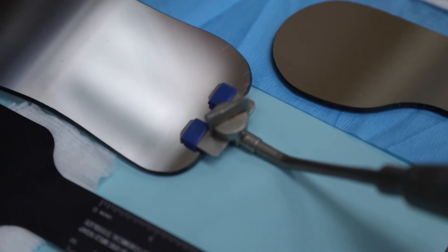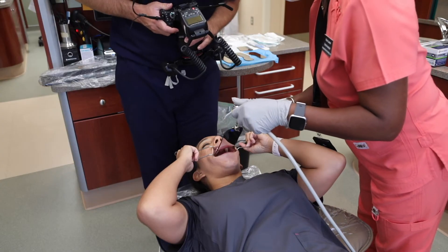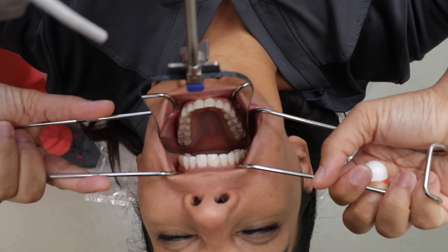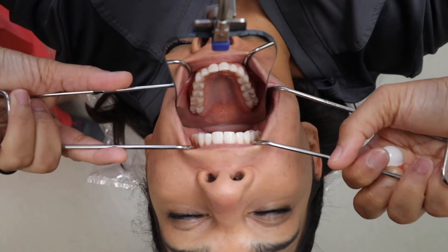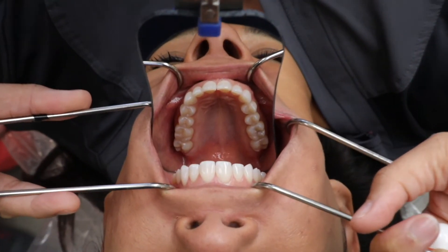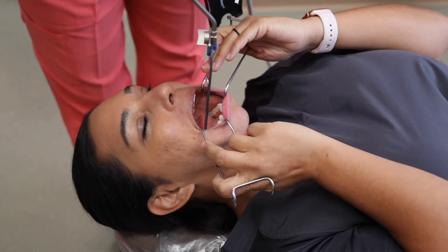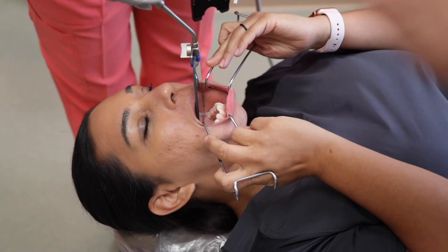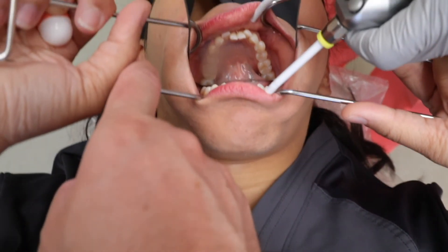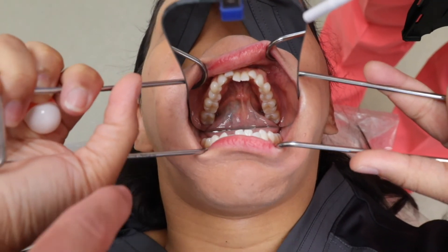Now we are ready to do the occlusal shots. I prefer my assistant to use a mirror handle to keep their fingers out of the frame. All occlusal surfaces of the teeth should be visible. The midline of the mouth is centered and you will want to focus on the occlusal grooves of the posterior teeth. For the maxillary, I ask the patient to retract out, forward, and upward — the biggest goal is to get the lip off the anterior teeth. For the lower occlusal view, the patient retracts out, forward, and downward. If possible, ask the patient to put the tip of their tongue in the roof of their mouth and have the assistant retract the tongue backwards with the mirror. Sometimes this is uncomfortable or impossible, in which case just have them keep their tongue down and relaxed.